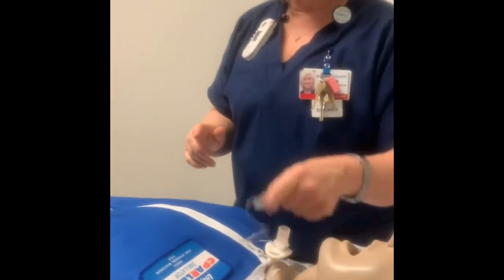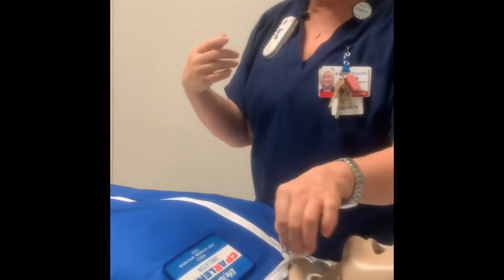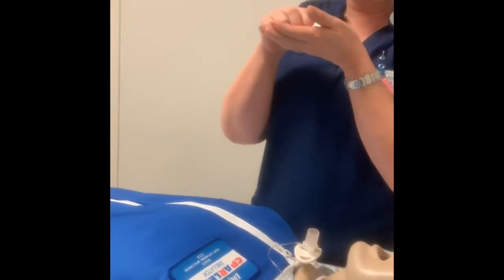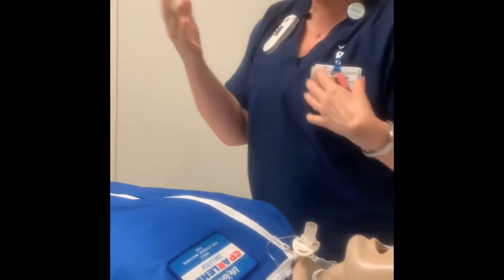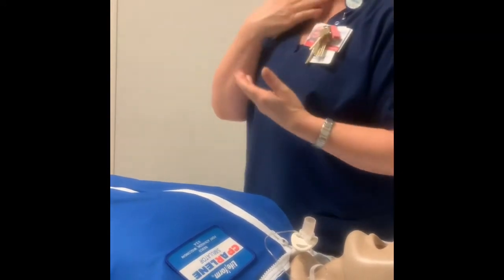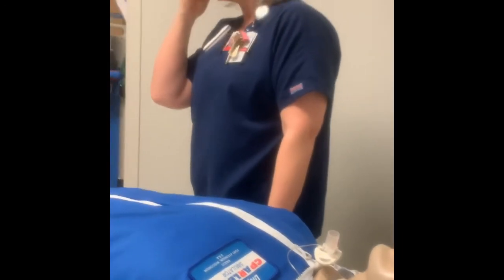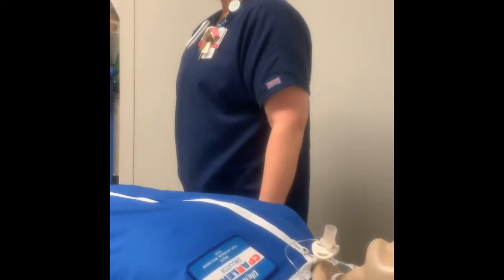Suctioning. The other thing real quick here, and we'll talk about cleaning the trach. Make sure that you keep these little crumbs, I call them crumbs, they're like scabs or things that have built up, cleaned off from that trach because they can slip into the trach. So you want to keep those cleaned up.